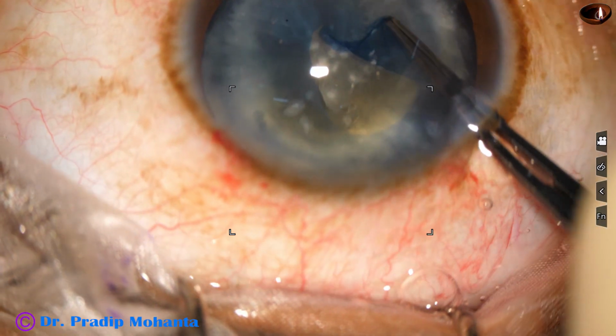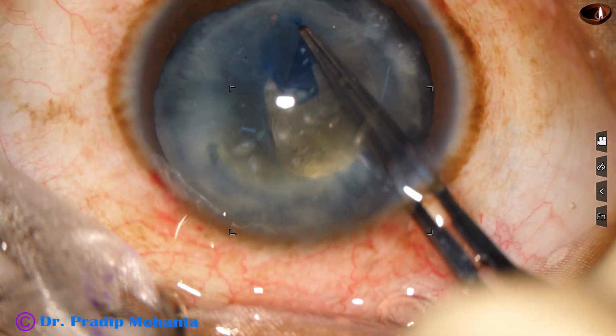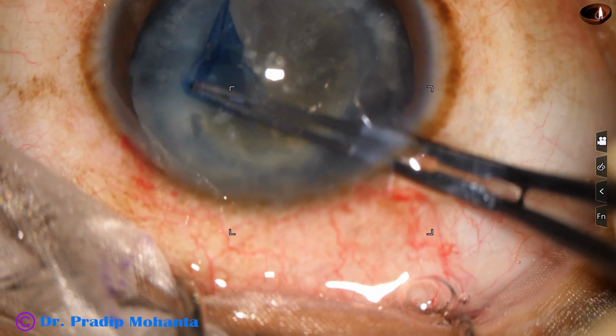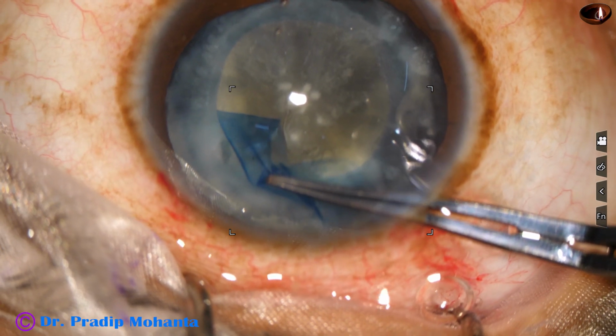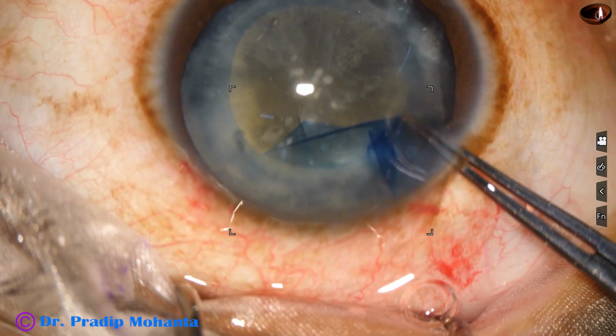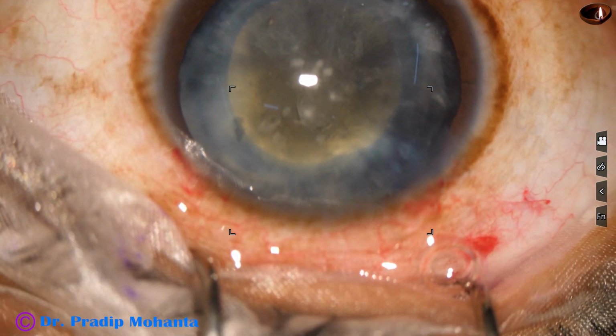The anterior capsule has been incised with a sharp needle because the zonule may be weak since there is history of trauma, and a rhexis is completed. Size of this rhexis is about 5.25 millimeter.